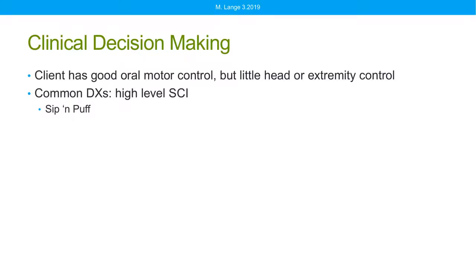And we had to stop his driving there for a moment because an 18-wheeler decided to go right down the middle of that parking lot, and we needed to move Jonathan out of the way. It didn't look like the truck was stopping. So the head array is probably one of our most common alternative driving methods. It is non-proportional. It works very well, again, for clients who may have good, fair to good head control, but not a lot of control over their arms and legs.